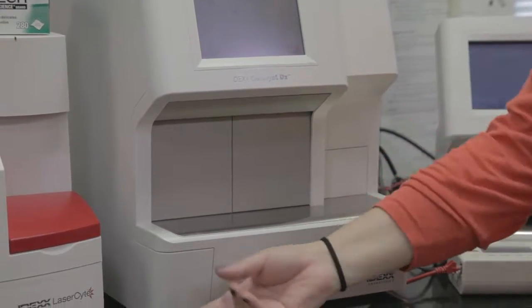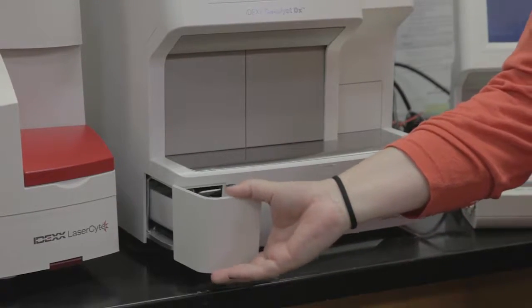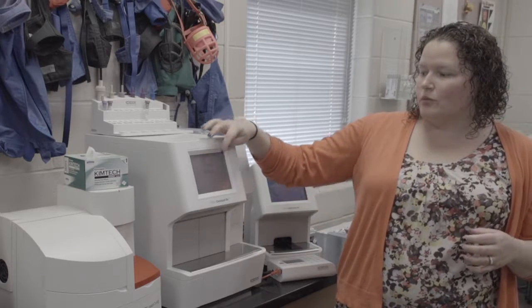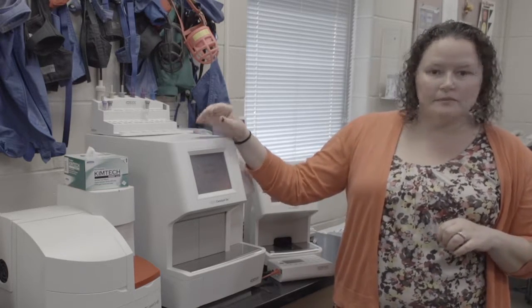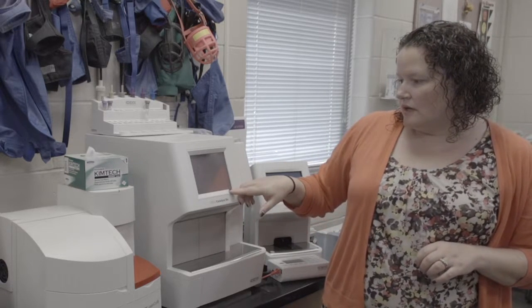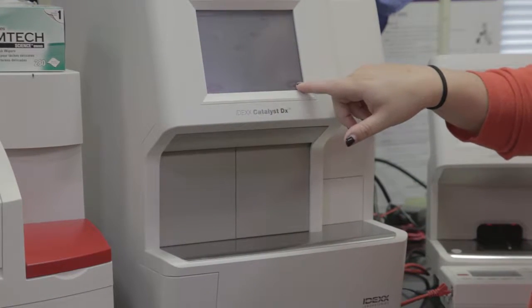Down here below, we have your waste container, which should be emptied after each run. That being said, it will keep track, and it will ask you to empty it if it feels like it's too full. When you open and close it, it's going to ask you if it's empty. If you didn't empty it, if you just opened it to look, don't lie to it. Just tell it, no, it's not empty. If you say, yes, it is empty, it's going to reset its count, and then you could potentially end up causing a slide jam. So that was empty, though. Okay. All right. So I'm going to show you how the drawer opens and where everything would go.